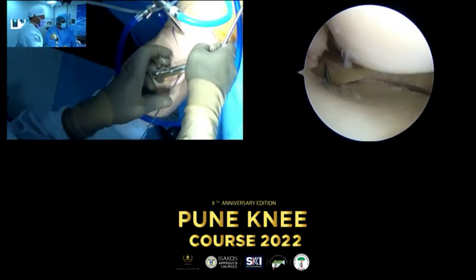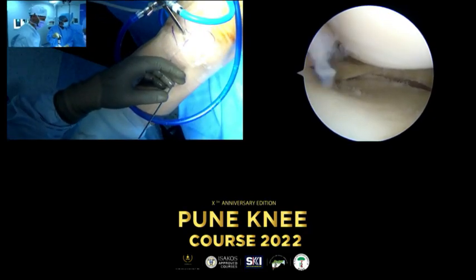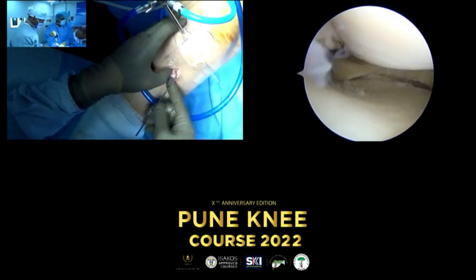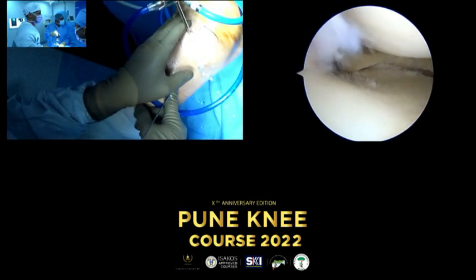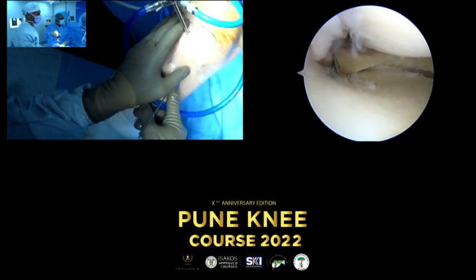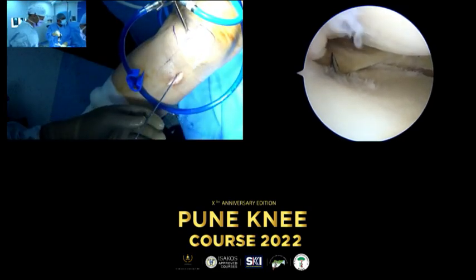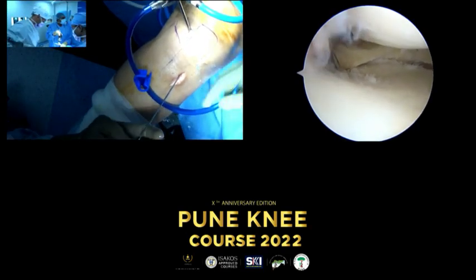So that was one of the questions I was going to ask you. Since I had put in a titanium screw, do you want to take it off before you start? Yeah, I forgot that issue. Thank you for saying that. If I can go through it, I will keep it. Otherwise, I will have to take it out. Hopefully, I will not.